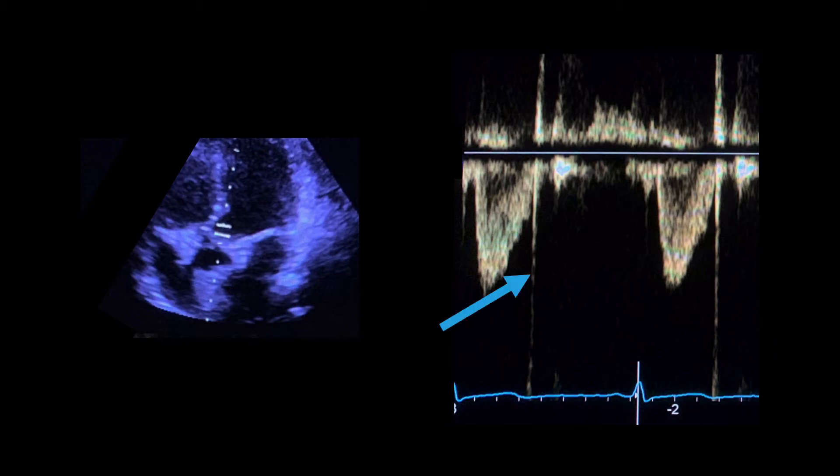Ideally, an indication of the aortic valve closing click will be visible on the Doppler signal. When correctly sited, a smooth peaked velocity curve should be seen, from which a velocity-time integral measurement can be made by tracing around the waveform.